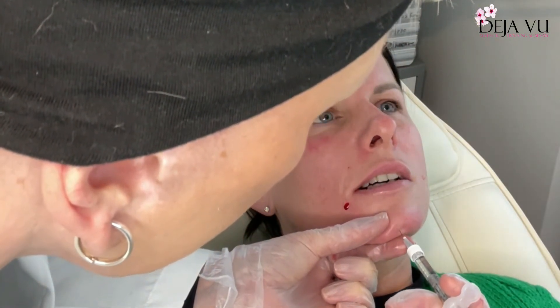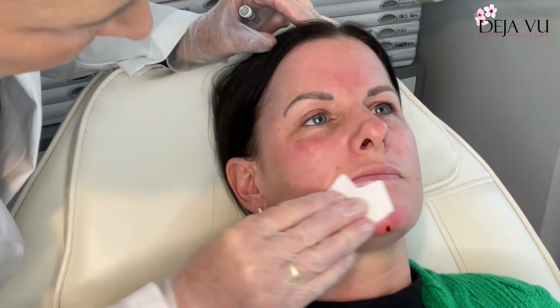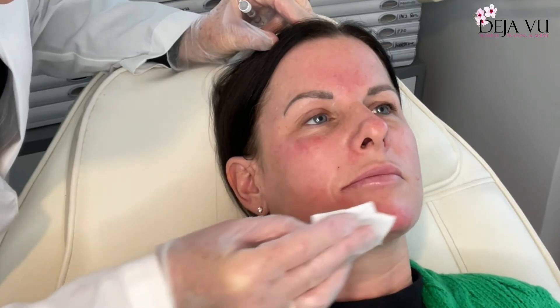Then we're going to look at the apex of the chin. I just need to make this a little bit longer, so we're going to go in at about 45 degrees, going in there down to the bone, aspirating again, and injecting slowly. Coming out. Just wipe some of this away.